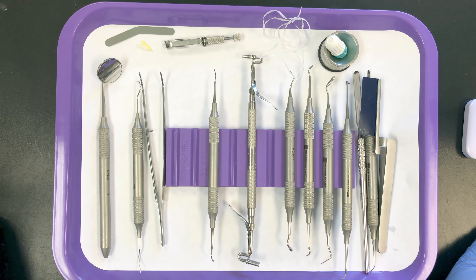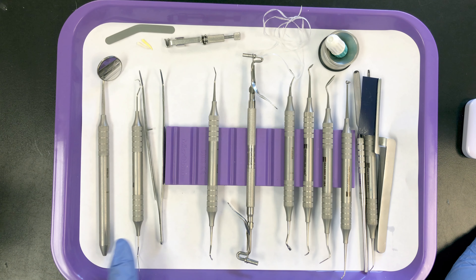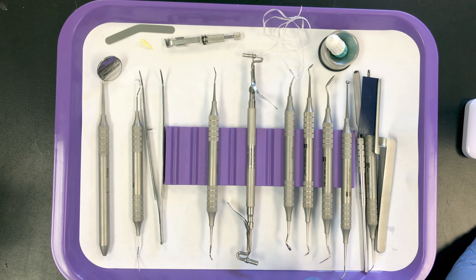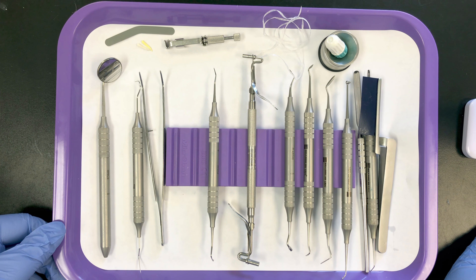Hi everyone, thanks for joining in. This video will show you how to set up an amalgam tray. As an assistant, it's our responsibility to set these trays up in order of use, so we need to know the sequence in which the doctor will use these instruments, and we have to make sure we get everything they would need on the tray.